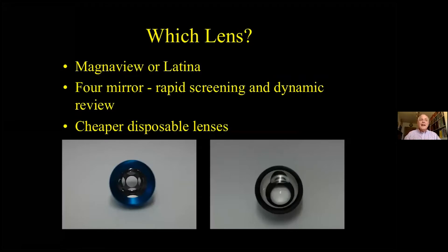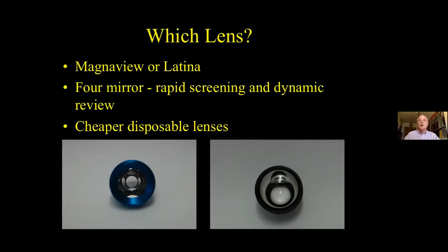Which lens to use? The MagnaView and Latina lenses give a superb view, but it's harder to indent the cornea, and they need a coupling agent. A four-mirror lens allows rapid assessment of four quadrants and indentation. Also available are cheaper, disposable plastic lenses.